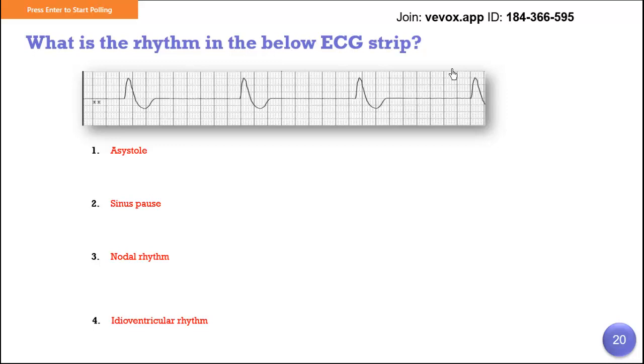So I'll give you a clue, just because I'm a very kind guy here. Is it narrow or wide? It's wide. So is it atrium or ventricular? Ventricular. So I think I helped all of you.